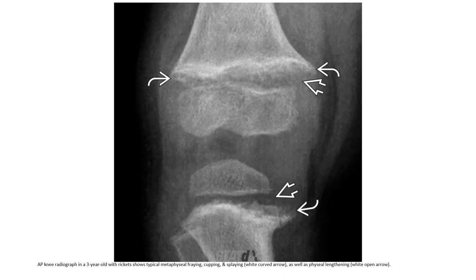AP knee radiographs in a 3-year-old with rickets show typical metaphyseal fraying, cupping, and splaying, as well as physeal lengthening.